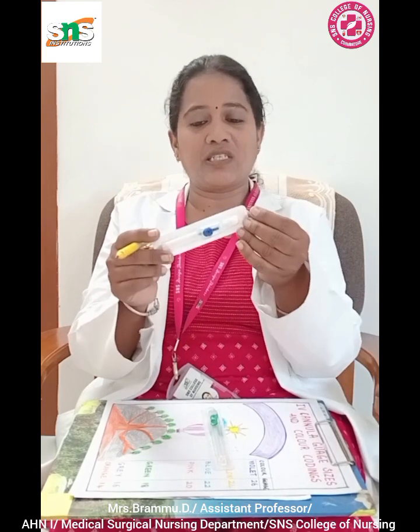You may wonder why we are dealing with the parts of the IV cannula. As healthcare workers, understanding the parts of the IV cannula is crucial, so that we can get deeper insights into the main functionality of this medical marvel. Next we will see the luer lock plug, the first part of the IV cannula.